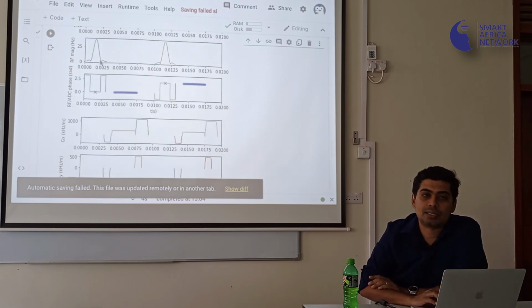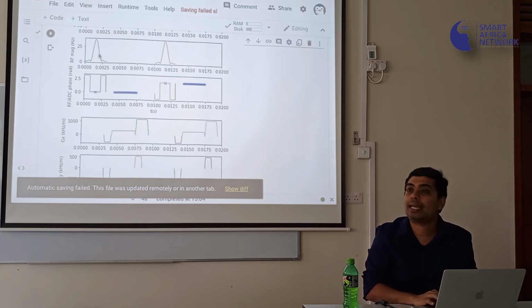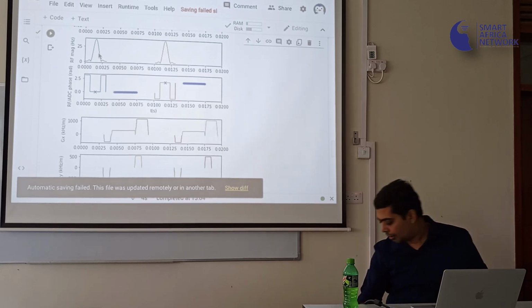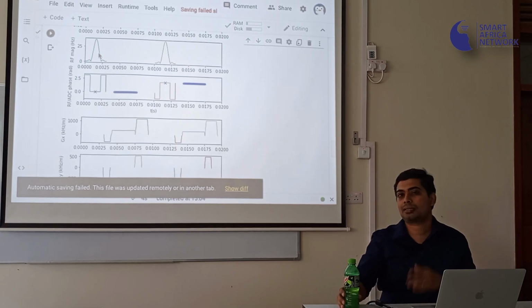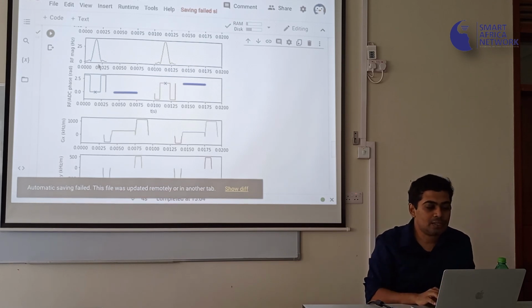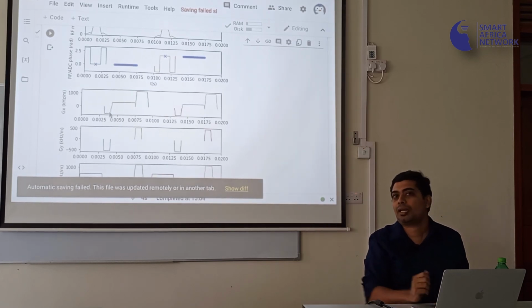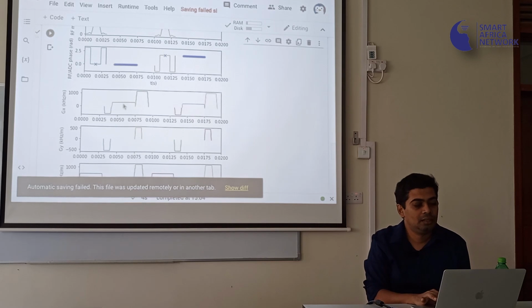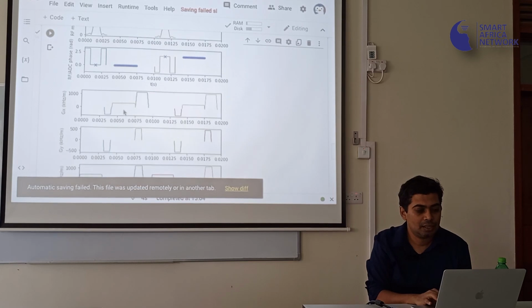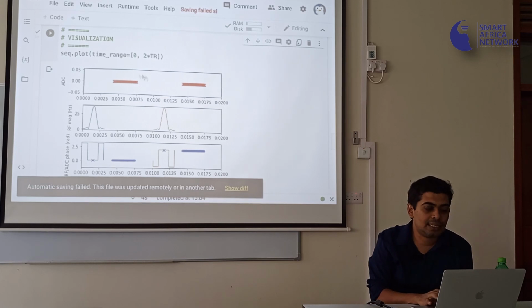So here's what's happening. This is your antenna, the RF coil that you're going to see downstairs. This is basically saying send a signal on that RF pulse. The way you do it is by sending a current with a frequency that is decided by the magnetic field strength, so you can be resonant. Once you send that, wait for some time, and then send the current to another coil called the gradient coil. Have it on for some time in the opposite direction, and during this period, you get what is known as the echo, and that's it. So that's the receive or the ADC.